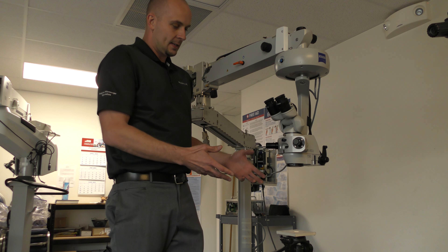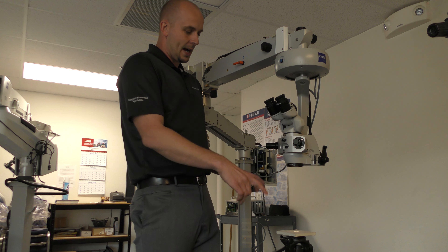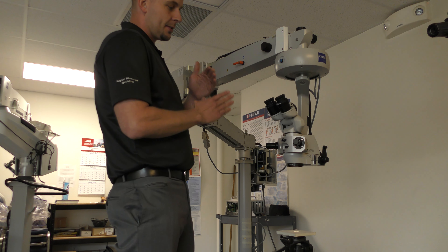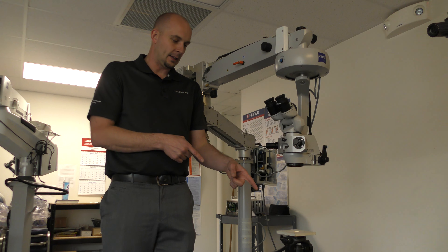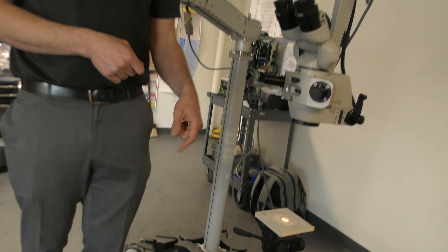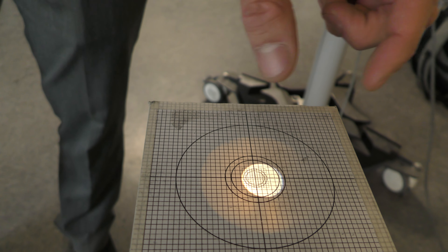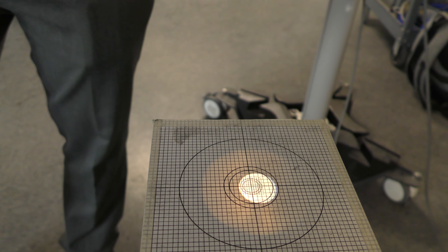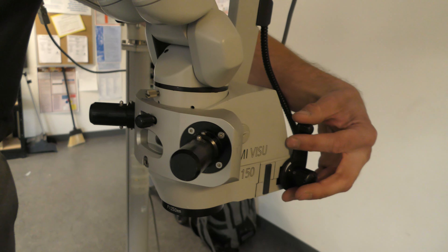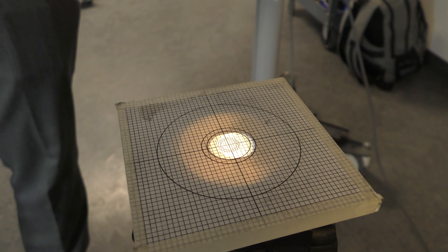The way that's going to look — and this will illustrate things for both systems — right now I've aligned the graph to where the crosshairs are perfectly centered in my field of view. But when you look at the graph and the light coming out of it currently, you'll see that the light is shifted north ever so slightly. Where it should be is centered on that graph perfectly, and it's not. In addition, this has two lights, so you can see the secondary light is off as well — it's low.